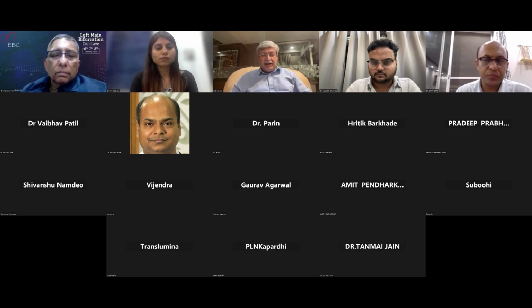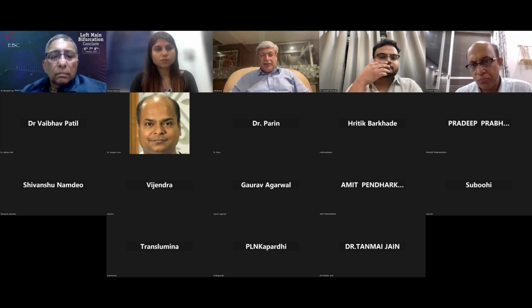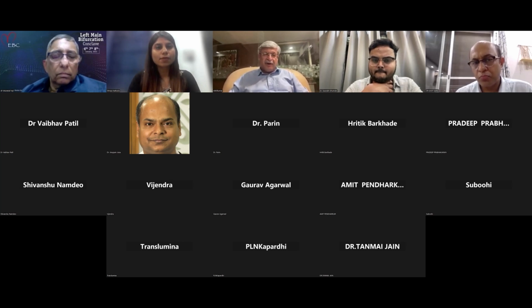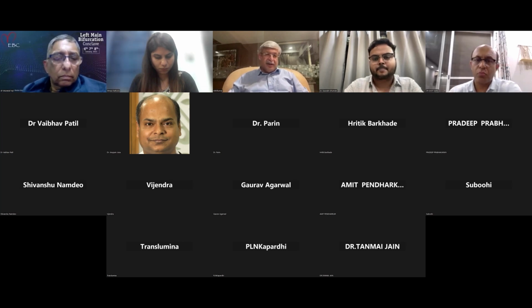So balloon dilatation, yes, for placing an IVL, if you decided on IVL, or if you decided on rotablation, then of course you don't need to pre-dilate at all. But the management of the calcium should be done before attempting it with the balloon. I think you should decide, yes, I want to do it, or I don't want to do it. I've never regretted taking up a strategy upfront for managing calcium, rather than later, when I have, at one odd time, regretted not using the device, whatever you want to do.